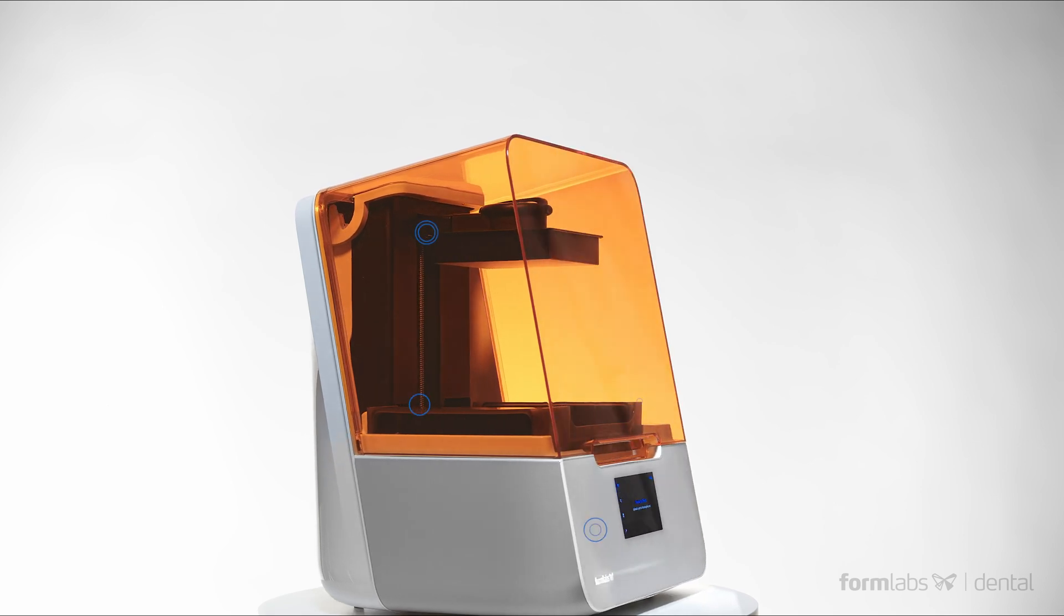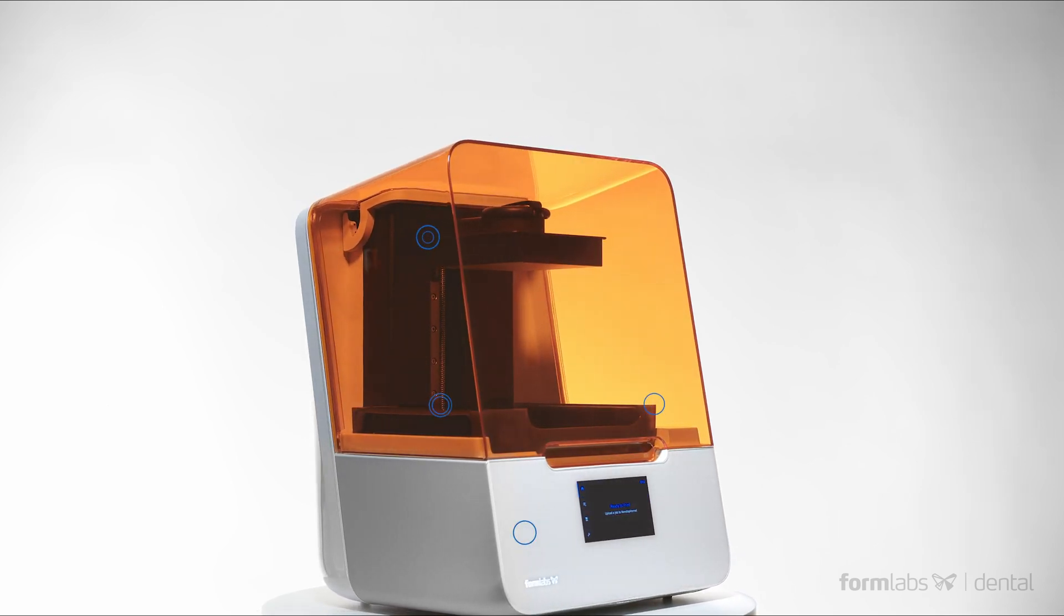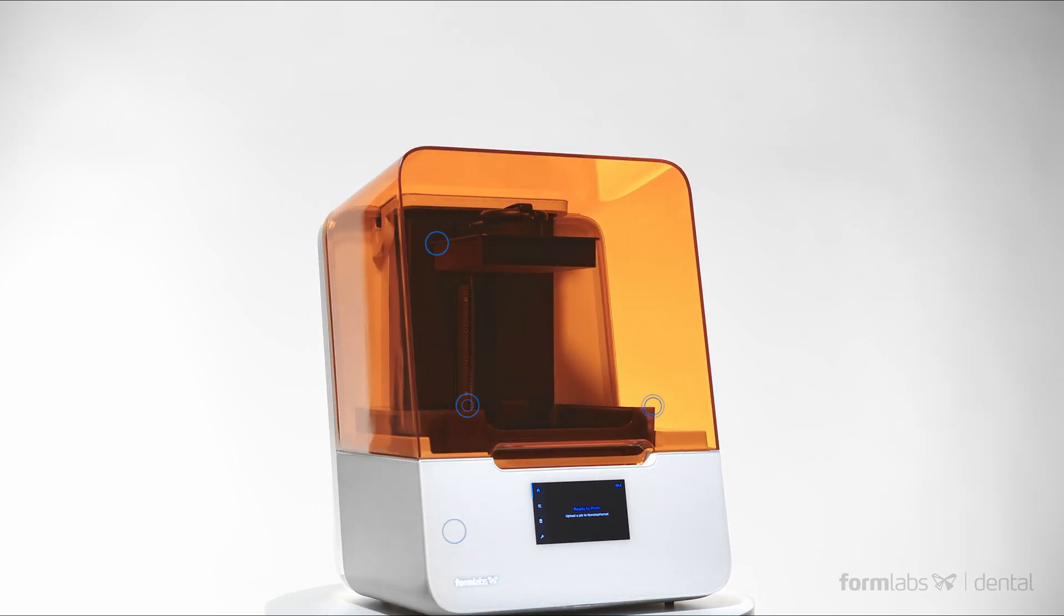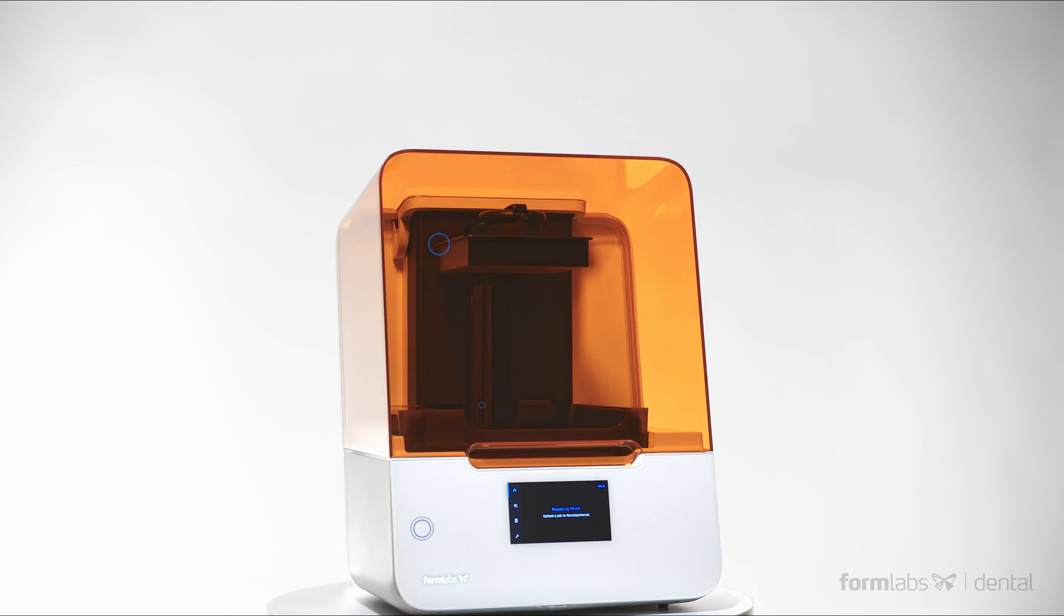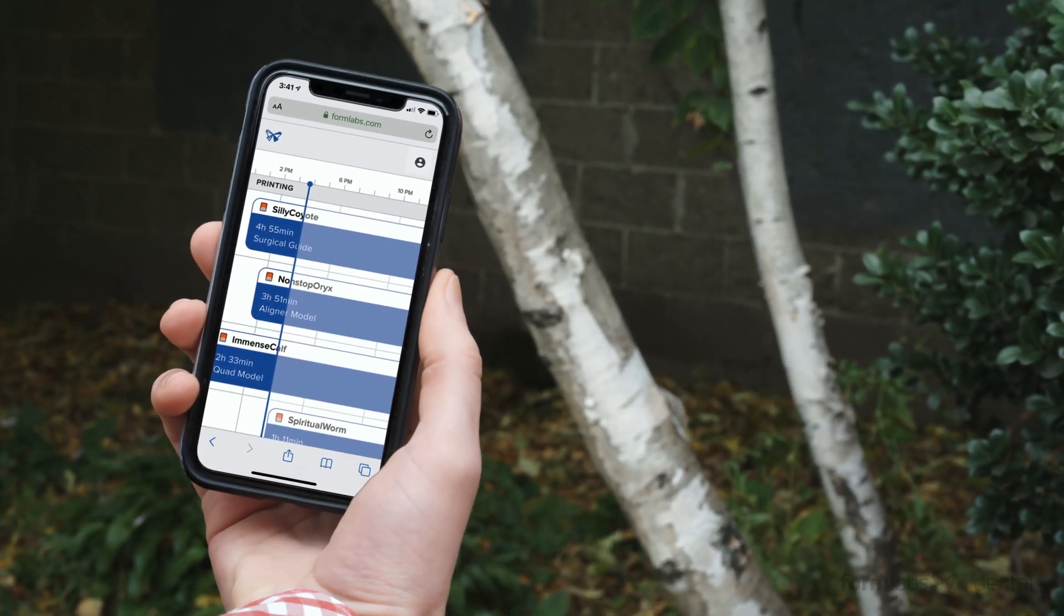New smart sensors constantly monitor print progress and keep you informed and ready to promptly address potential issues. The remote printing feature and dashboard interface allow users to monitor the progress of massive batches of parts from anywhere.